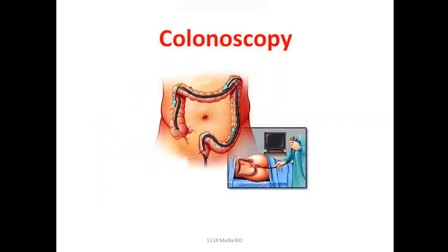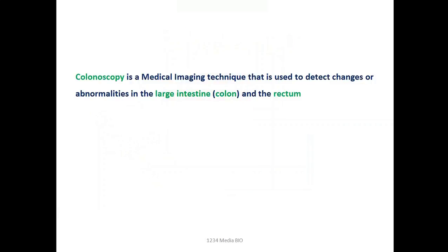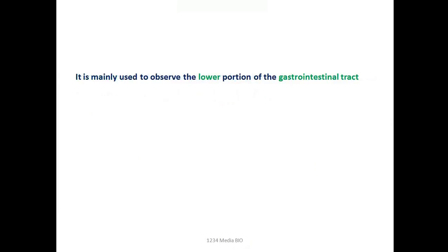So we'll learn about colonoscopy, and I think you should watch the Introduction to Medical Imaging video first, before going ahead with this. Colonoscopy is a medical imaging technique that is used to detect changes or abnormalities in the large intestine, also known as colon, and the rectum. It is mainly used to observe the lower portion of the gastrointestinal tract.